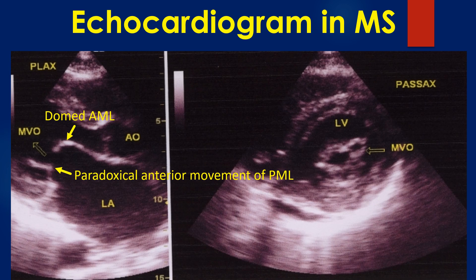Paradoxical movement of the posterior mitral leaflet is also visible. Normally, the posterior mitral leaflet moves posteriorly in diastole. Here there is a paradoxical anterior movement due to commissural fusion. The left atrium is dilated.